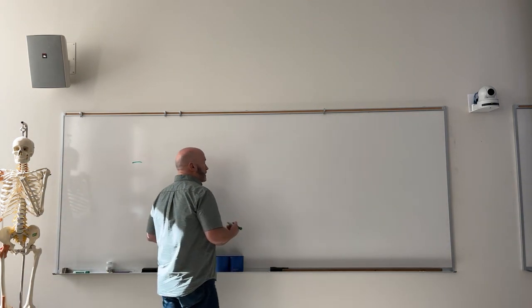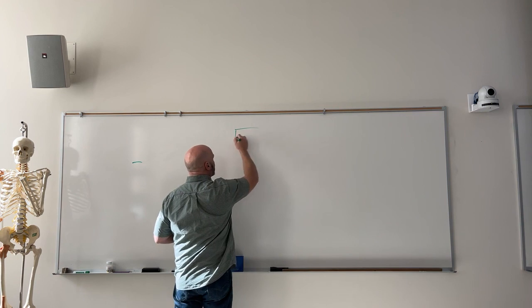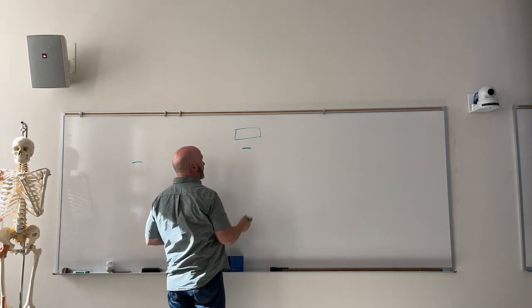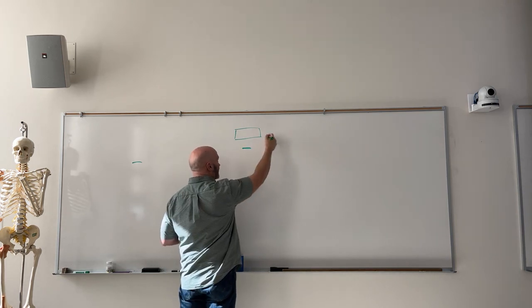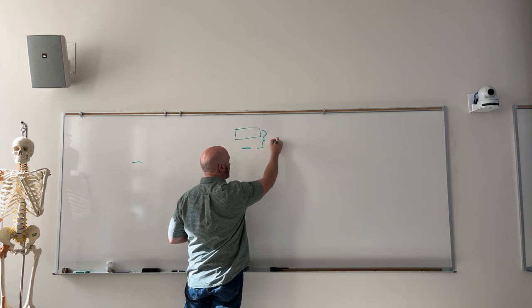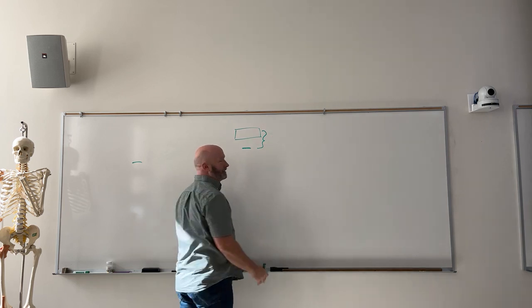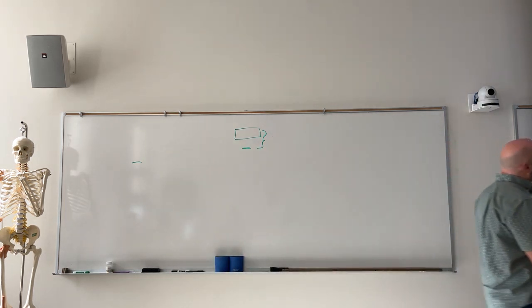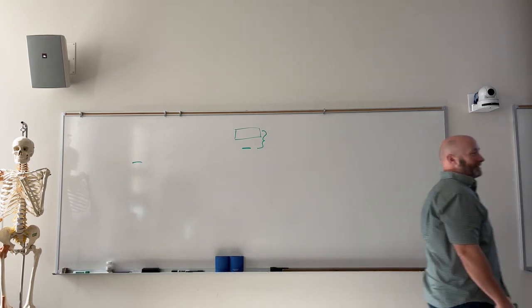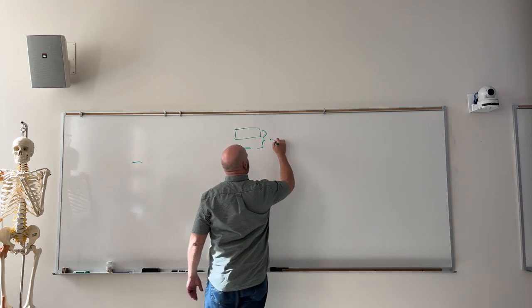So what I recommend you do is go ahead and draw it out. You've got an X-ray tube, and then you've got collimator housing, and then you've got some sort of diaphragm at a distance from your focus. So how far does it say it is? Just read it, right? What does it say? 5 inches. Thank you. It's 5 inches.